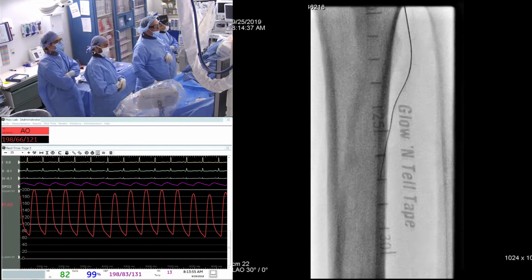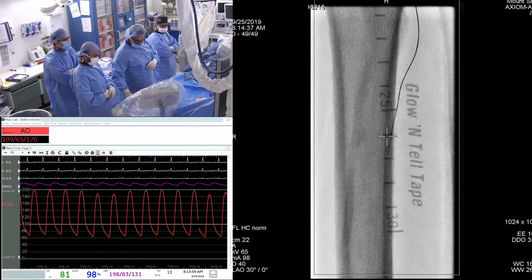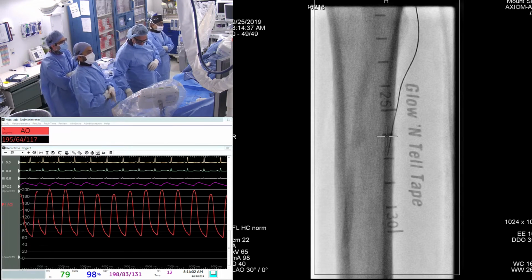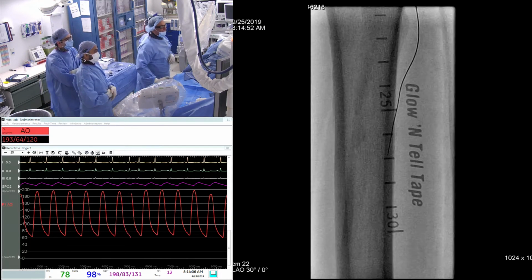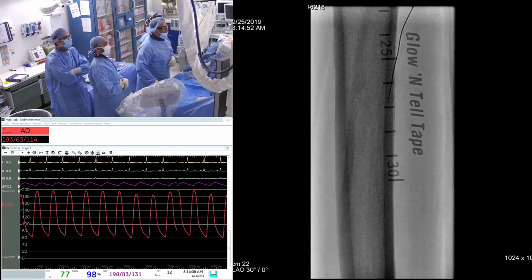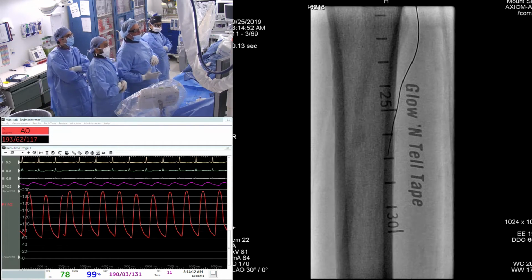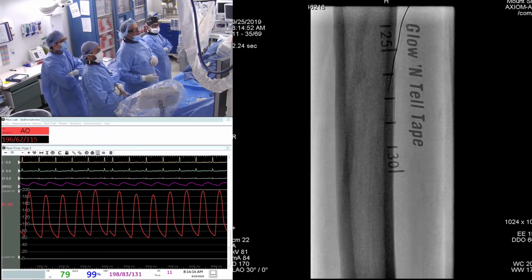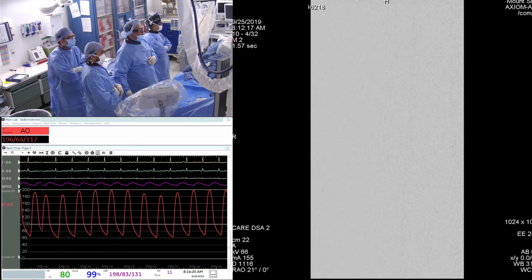So I seem to be heading in the right direction, but I really don't know, and so I decided to take some pictures. It's important in terms of what support catheters we all use. We use a Teleport catheter, which is a catheter from CSI. That's a very, very slick catheter that helps us in tracking these. And it looks like we're heading in the anatomical direction of the posterior tibial. But I went ahead and did some pictures, which didn't help us a lot.